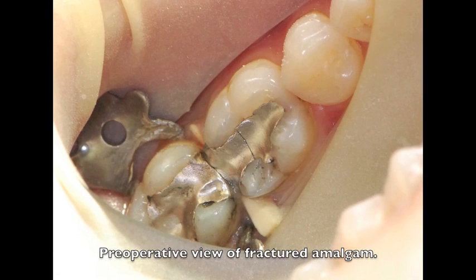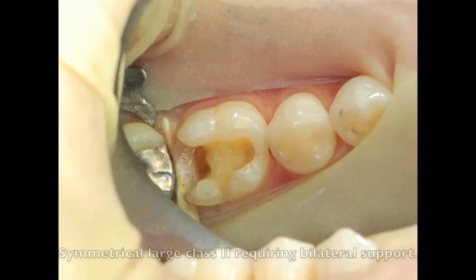This next patient presents with a clinical fracture of an old amalgam and radiographic evidence of decay underneath the existing amalgam. Upon examination of the final preparation, you can see there's still a little bit of decay left in the interproximal box, but it's bilaterally symmetrical. It spreads evenly on both sides, making it difficult to put a separating ring on without crushing the matrix band once again into the box.